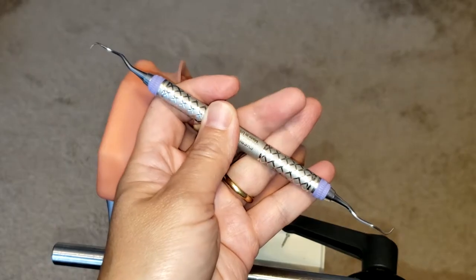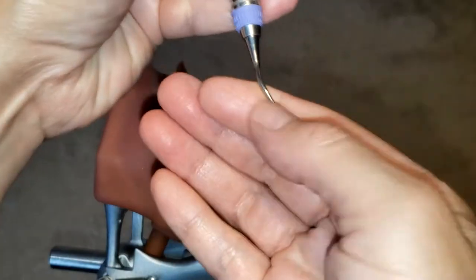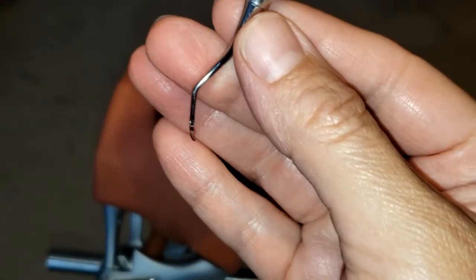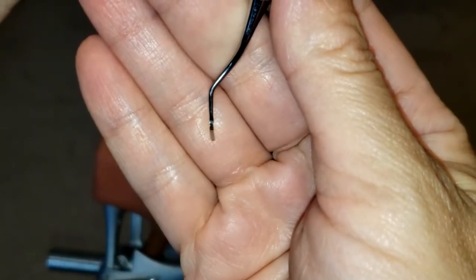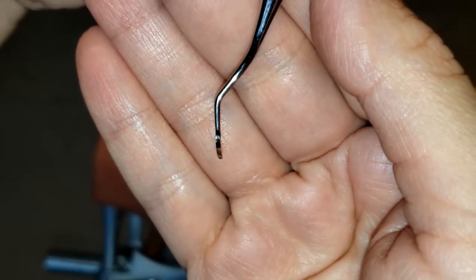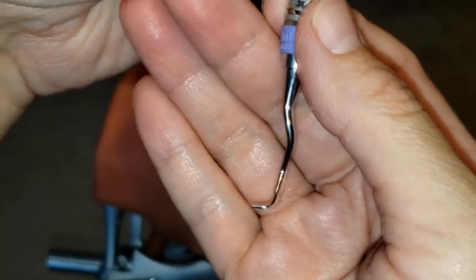This instrument, because it's a curette, has a rounded back and a rounded toe. If you take a closer look, the face tilts at approximately a 70 degree angle to the lower shank, and that is how you can identify the cutting edge of the instrument. Now I'm going to show you how to identify the correct working end and how to use it.